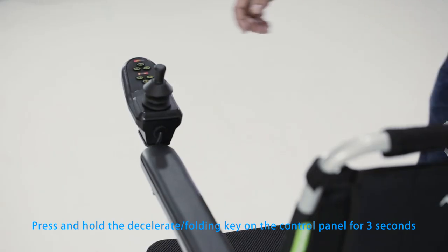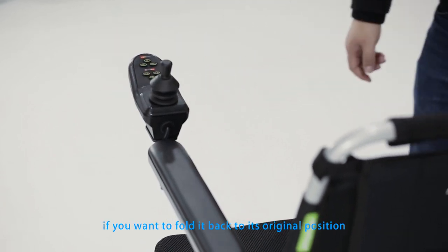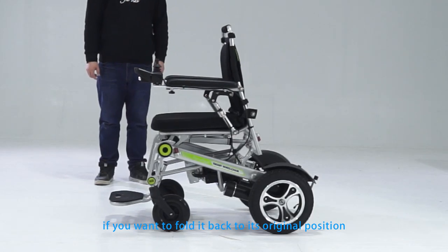Press and hold the decelerate and folding key on the control panel for three seconds if you want to fold it back to its original position.